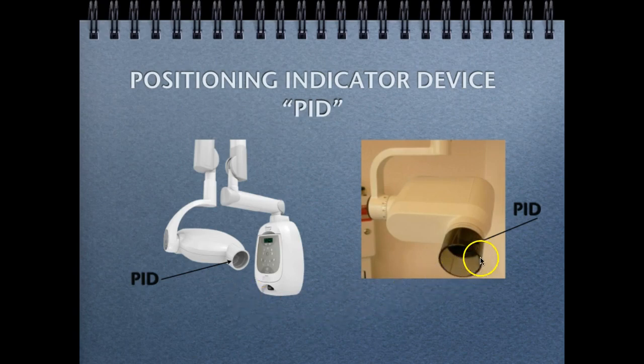And this is just another style of PIDs. They come in different lengths. They can be square instead of a round PID. And the actual particulars of the equipment will also be covered in another slide presentation.